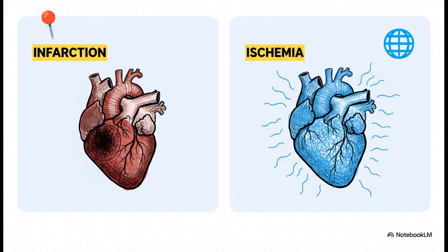An infarction, as we've been talking about, gives you ST elevation that is strictly territorial, almost always paired with those reciprocal mirror changes. Ischemia, on the flip side, is basically marked by widespread ST depression, or maybe newly flipped T waves that just seem to show up everywhere. It's totally non-territorial. It ignores those strict anatomical boundaries because the entire heart is collectively gasping for oxygen, rather than just one blocked-off neighborhood.